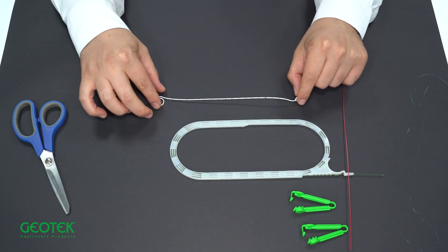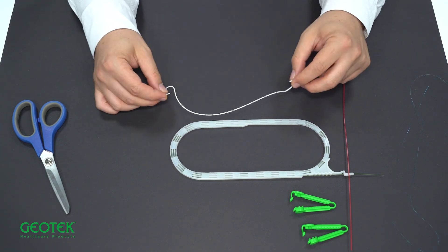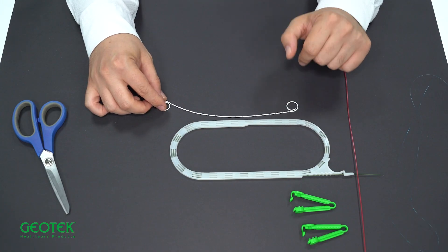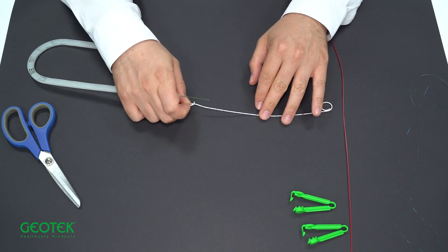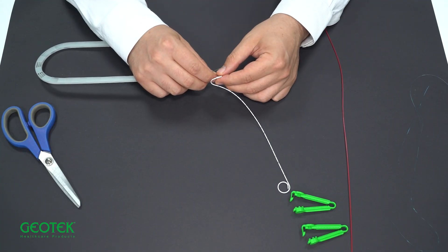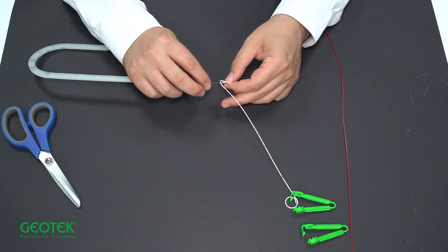Double J stents can be open at both ends, as in this example, or closed at one end. If both ends are open, the guide will protrude from one of the ends. Guides are hydrophilic, meaning they like the water environment. Therefore, we do not recommend using a separate lubricant. It will reach sufficient lubrication only when you wet it with sterile saline.